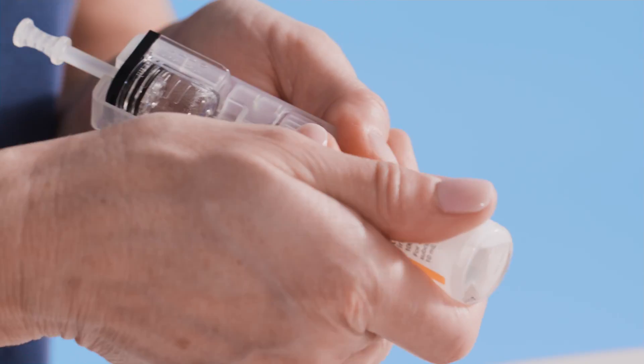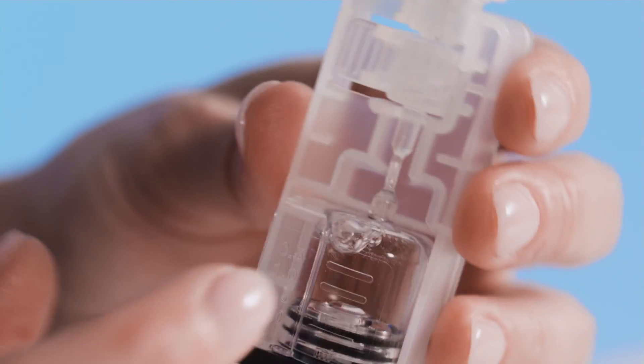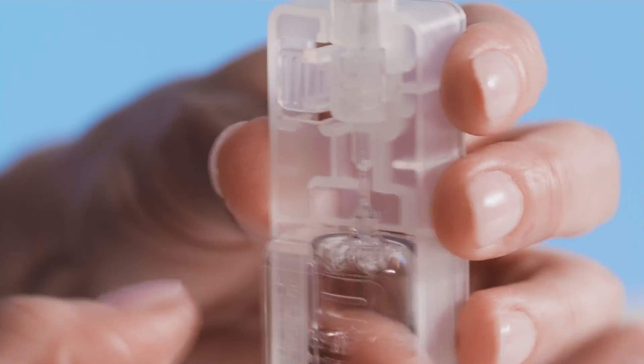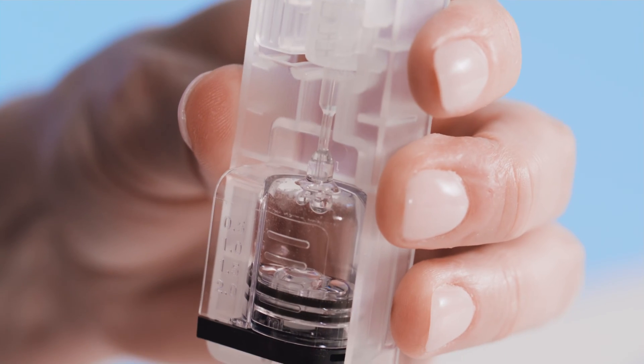Finish the fill process by removing the vial from the vial adapter. Next, tap and rotate the cartridge to release any potential air bubbles. If you see air bubbles, push up on the fill rod to force them out. Keep in mind that pushing out air bubbles may also push out some insulin. Be sure to check that you have enough insulin in the cartridge before moving on to the next steps.